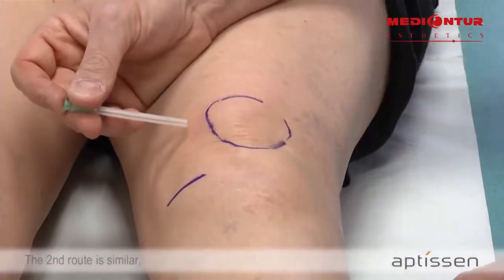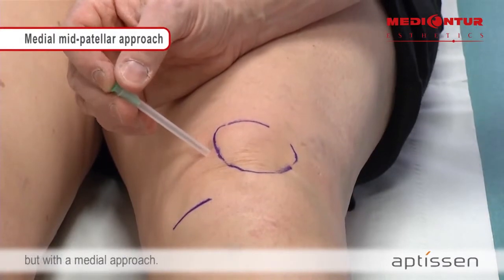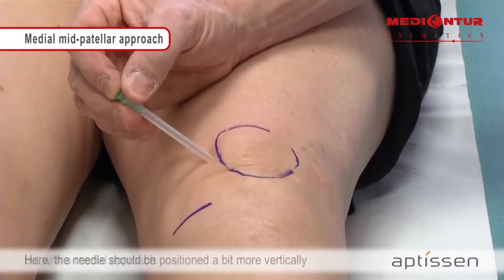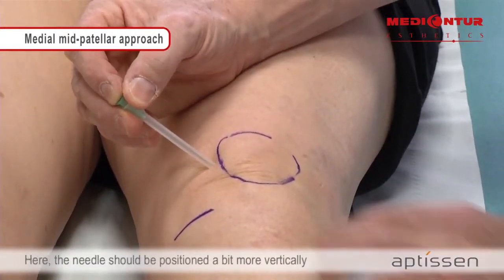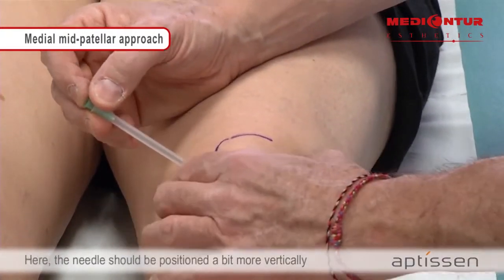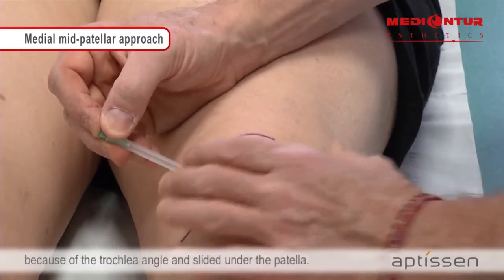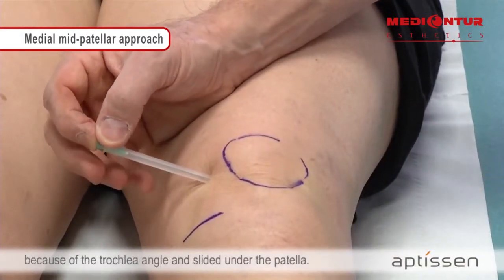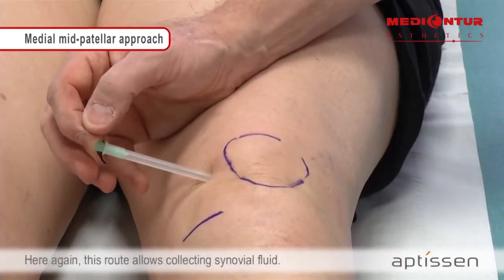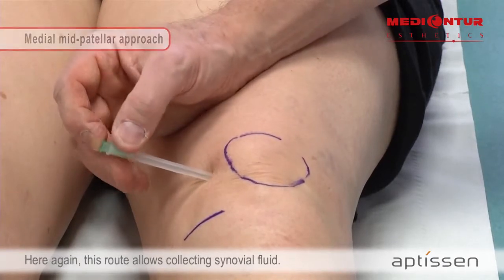The second route is similar, but with a medial approach. Here the needle should be positioned a bit more vertically, because of the trochlea angle, and slid under the patella. Here again, this route allows collecting synovial fluid.